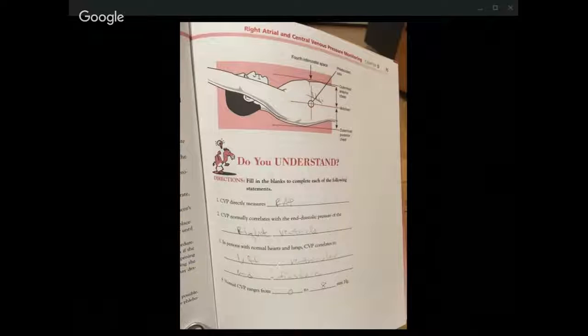What is the major advantage of a multi-lumen catheter instead of a single lumen catheter? A multi-lumen catheter allows for the simultaneous administration of fluids, and continuous CVP monitoring is not interrupted.